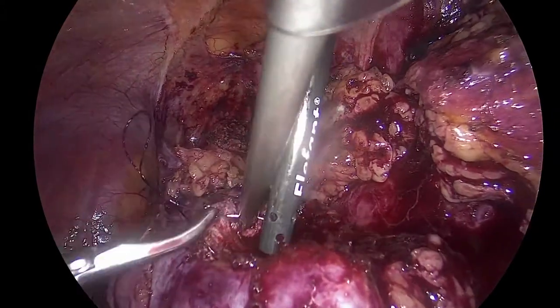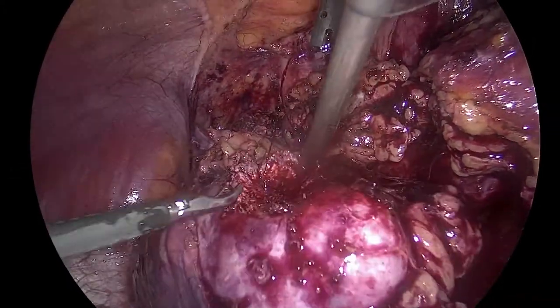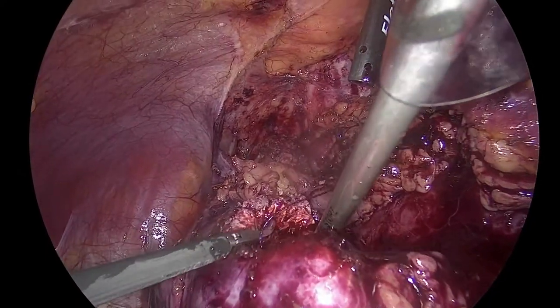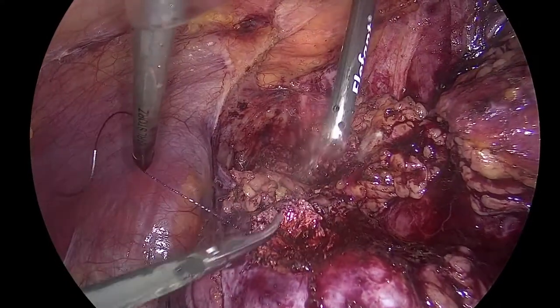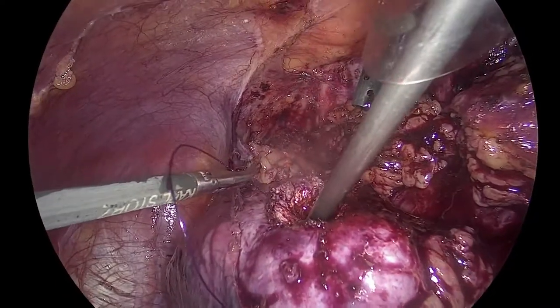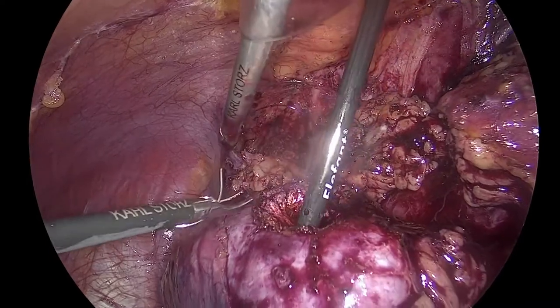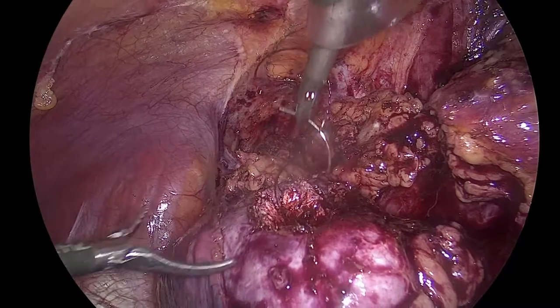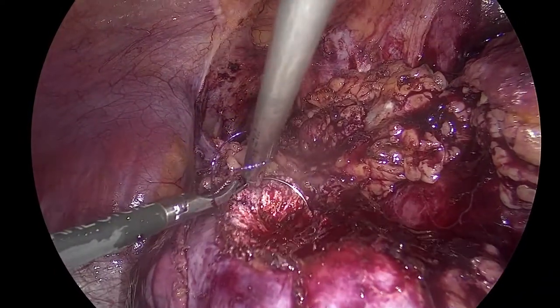You perform an early unclamping after this suture? Yes, if you are going to perform an early unclamping after the suture, to see also if there's any bleeder and where it is from. Actually, I'm going to perform the early unclamping before I finalize the suture. It's the only way to see where it's bleeding.